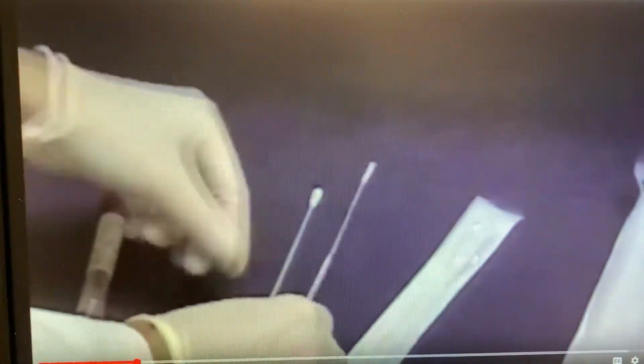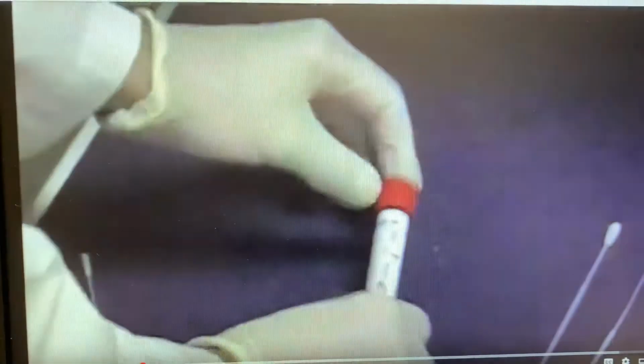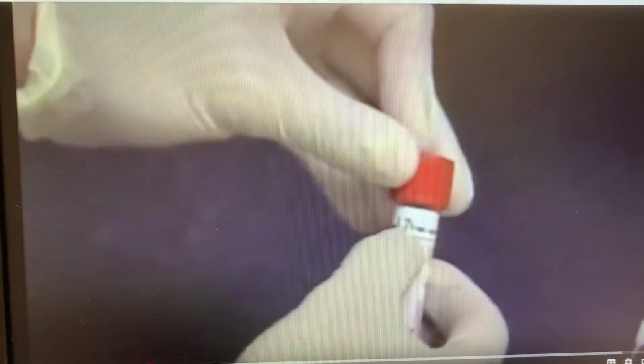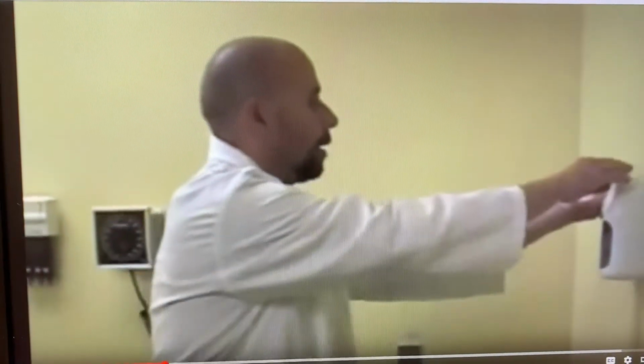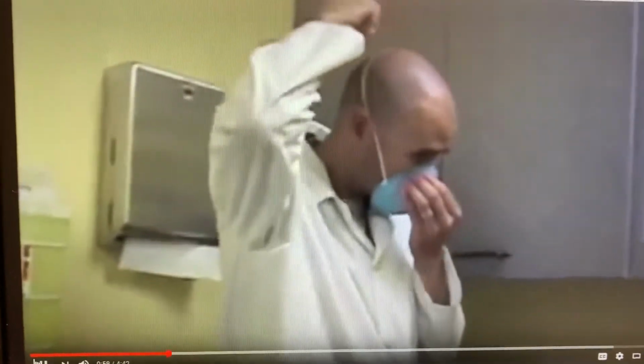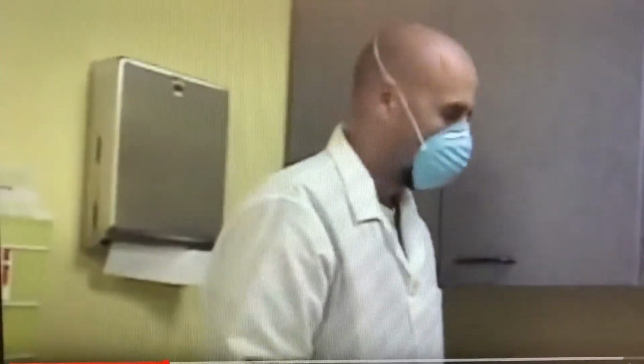If using the swab kit, use the smaller, more flexible swab for the nasopharynx. Ensure the viral collection medium has not expired, as expired samples cannot be processed. Always wash your hands before starting, and wear gloves and a mask to protect yourself. Patients are virtually guaranteed to cough or sneeze during this procedure. Make sure you change your equipment between each patient as well.